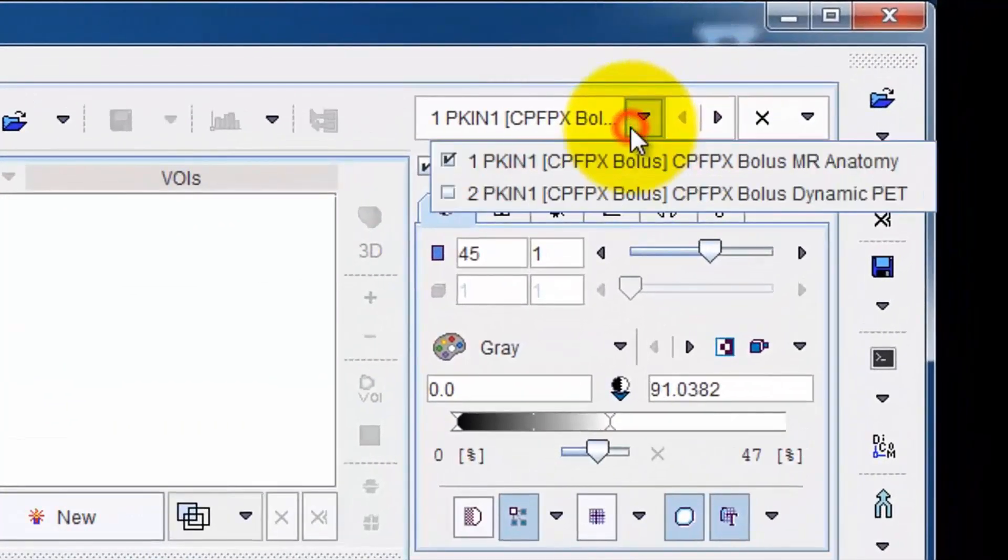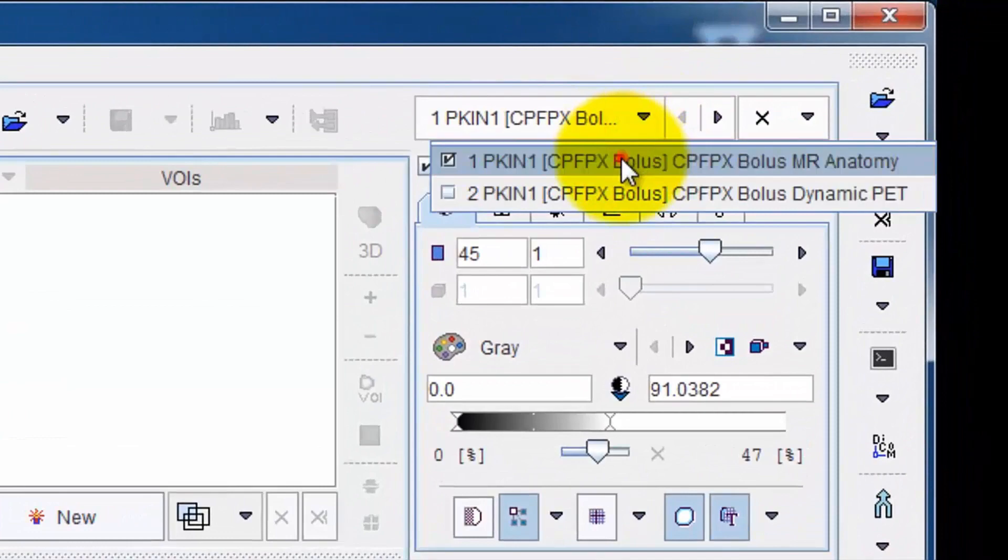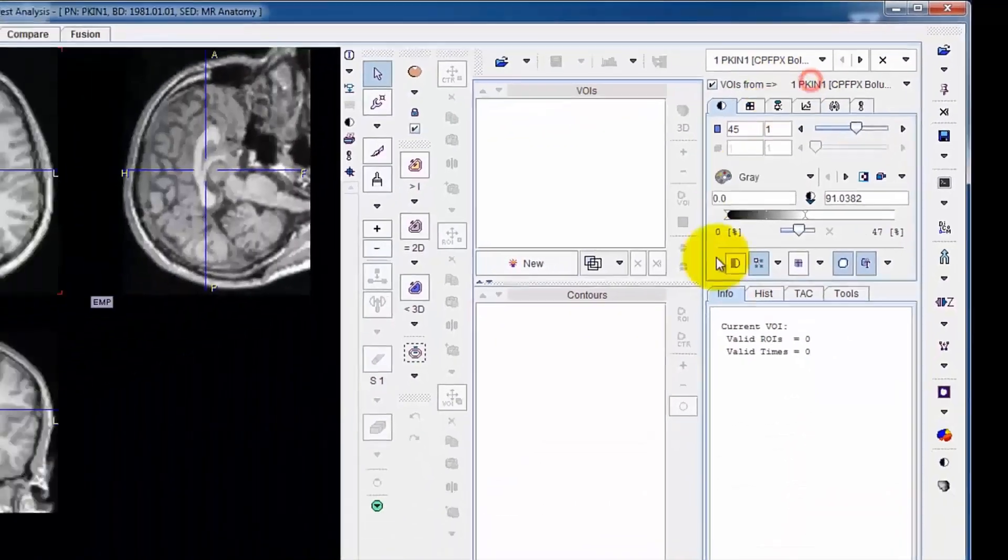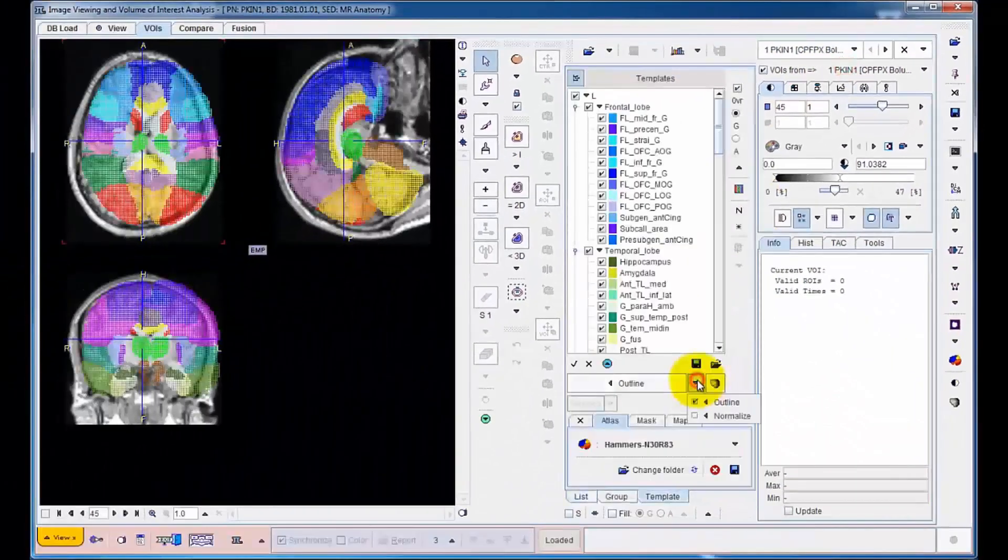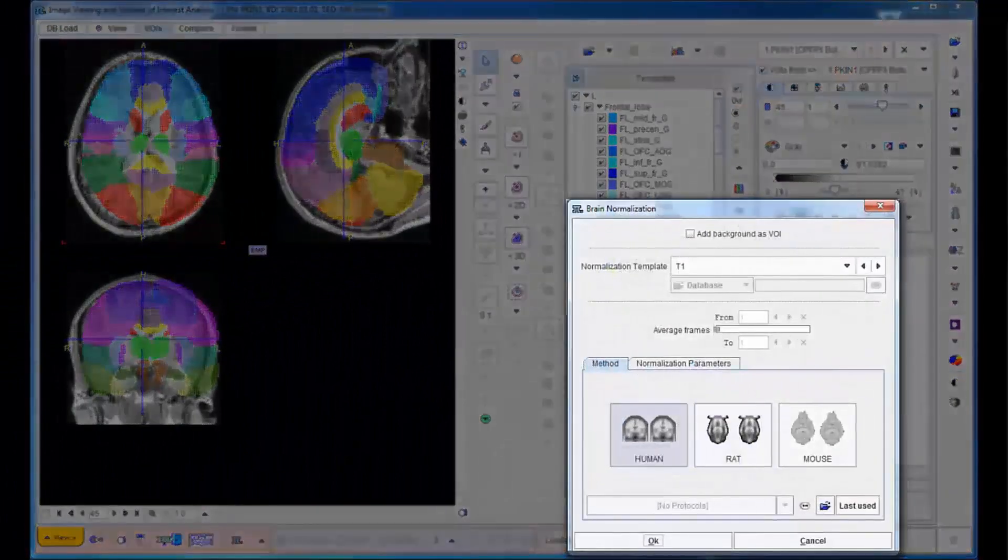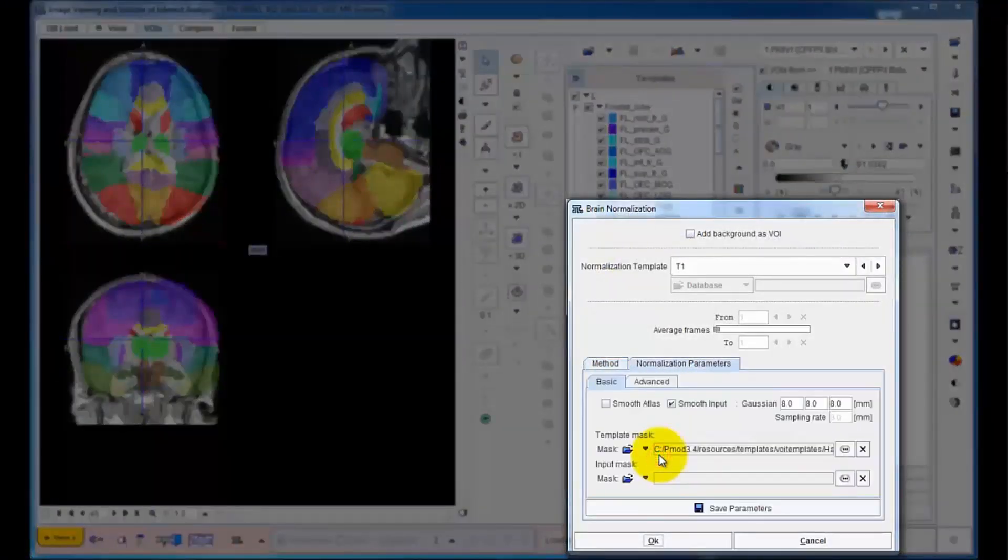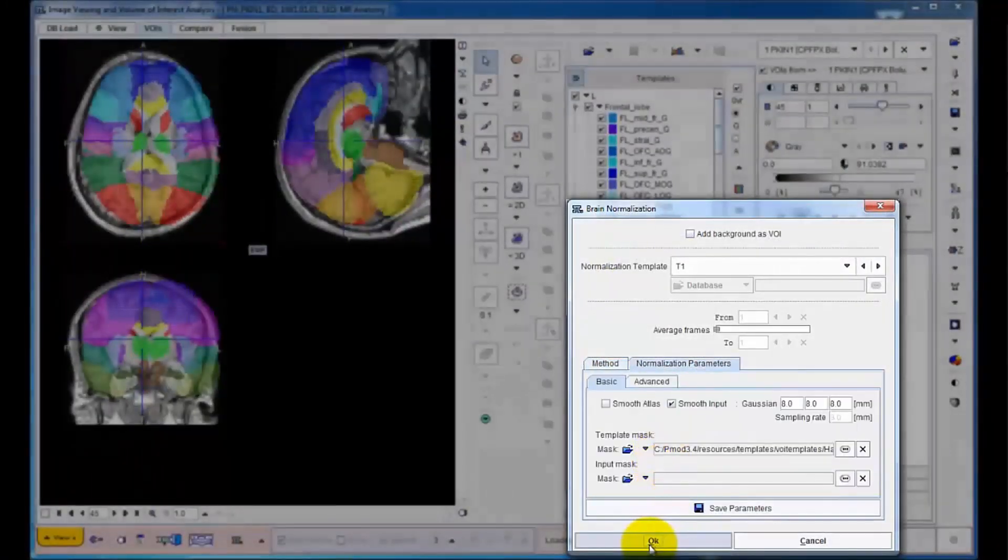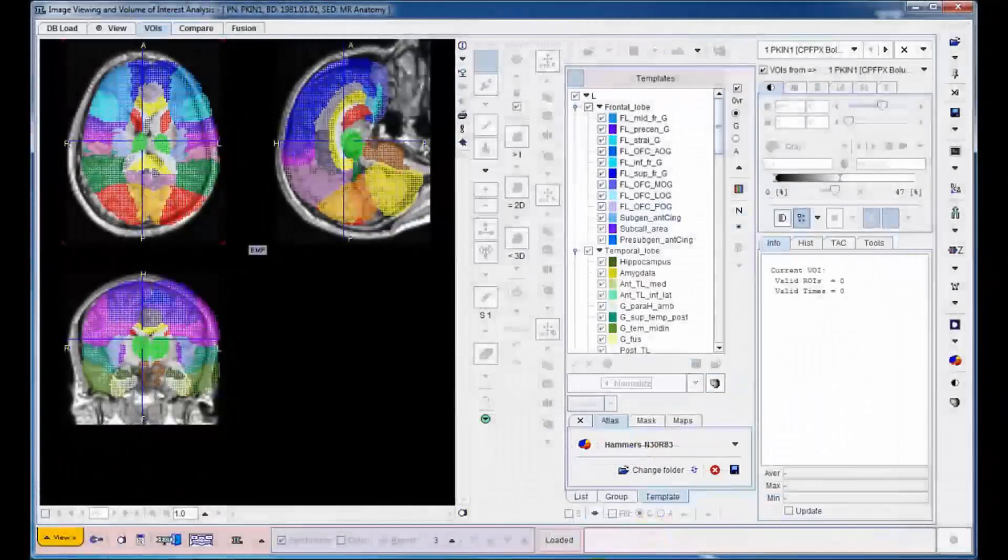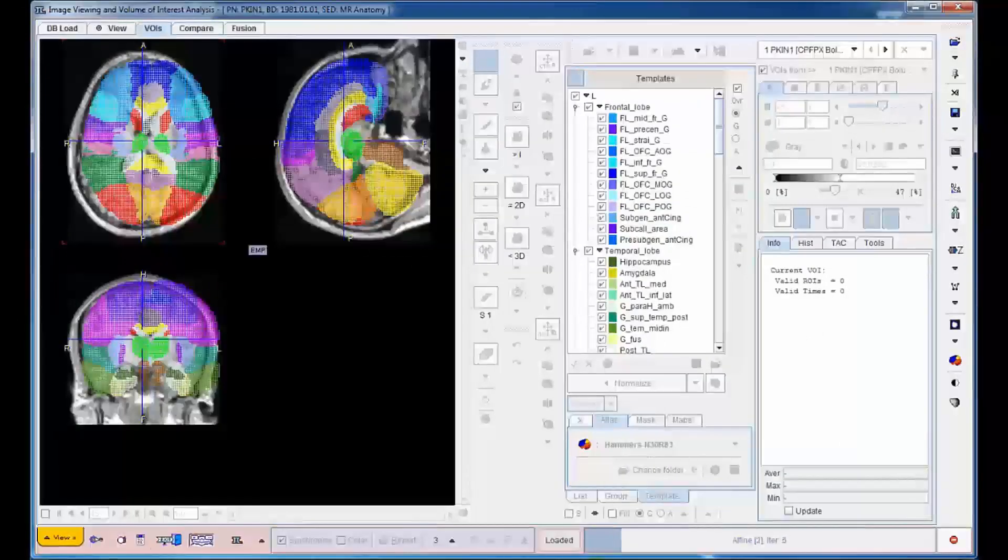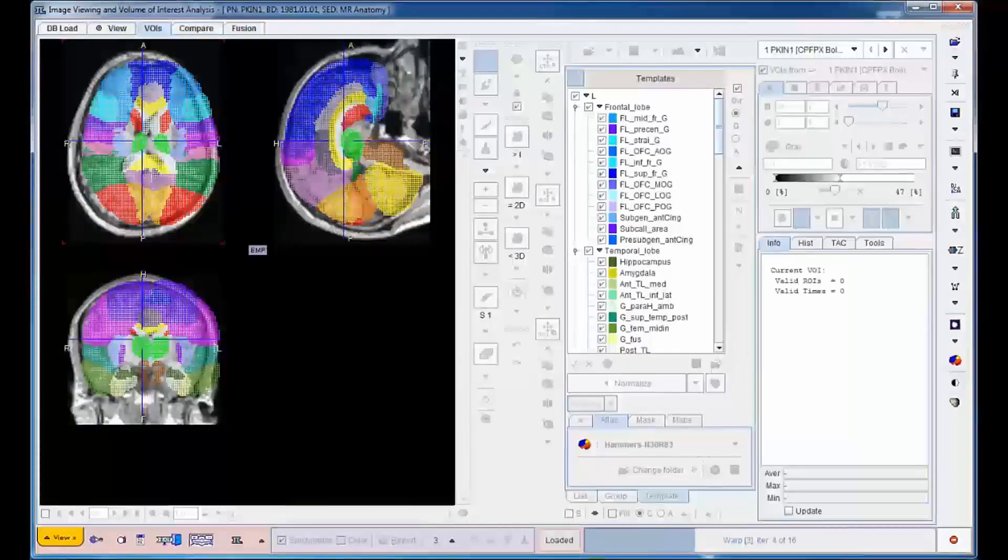First, the MR image is selected as it provides the anatomical structure. Then, the tool is configured and the calculation started. The resulting VOI outlines appear in less than a minute as an overlay to the MR image. The currently selected atlas corresponds to 83 brain areas.